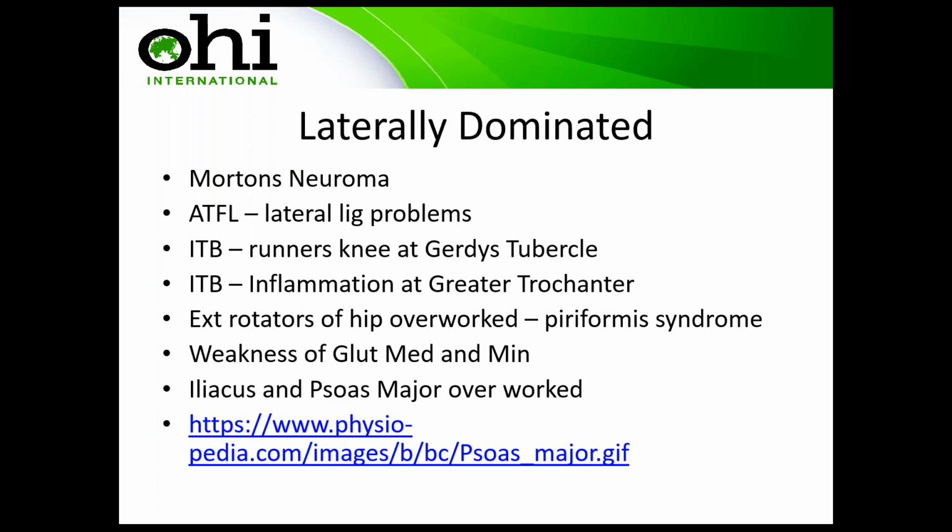I saw a patient last night, and she came in with tib post dysfunction. But when you saw how she walked, you just knew. When you saw her scan, she was externally rotating to offload, because her foot collapsed, loaded her big toe, and then she had to externally rotate really heavily. And when I examined her IT band, she was acutely painful. So she has two major problems, but the fact that her foot's loading very heavily through contact phase means that she's having to externally rotate because she can't bend her big toe. And that's why her IT band is really tight.